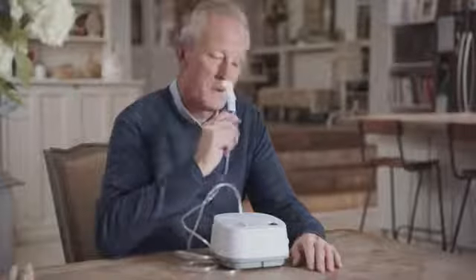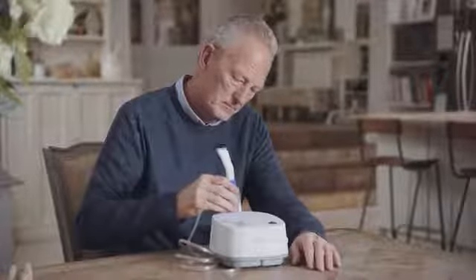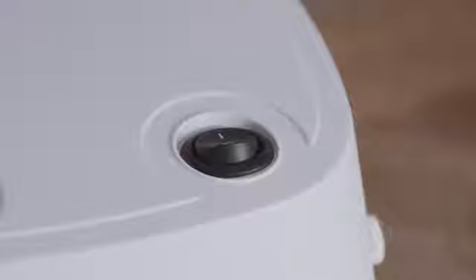When the SideStream begins to work intermittently and sputters, the treatment is finished. There is no need to nebulize every drop of your medication. There will always be a small amount left in the medicine cup. When your treatment is complete, turn the power switch off and unplug the device from the electrical outlet.